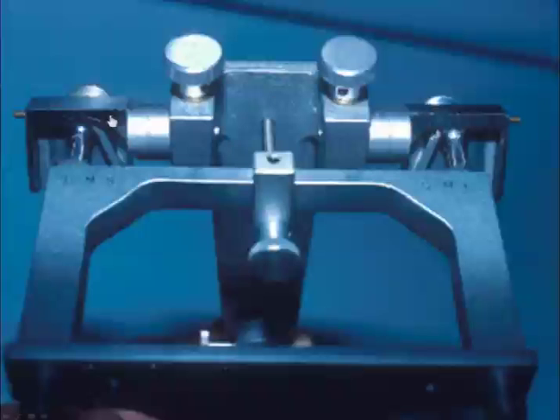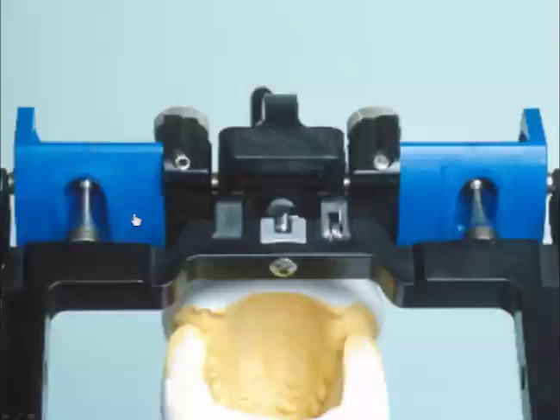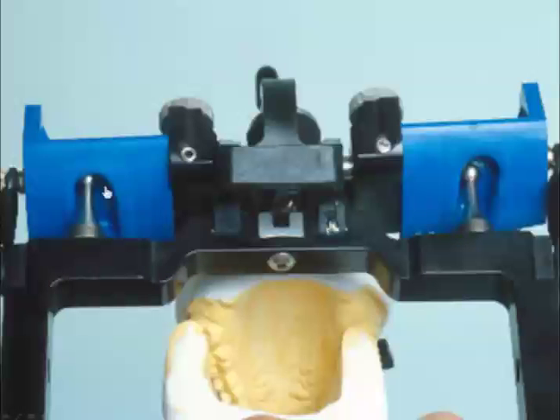So here we're showing the Whip Mix undercompensated straight line articulator going from point centric out to point Bennet, and the patient would chew a little beyond that in a curved pathway. And then here's the immediate side shift articulator. We'd go from point centric, shift straight over to side shift, and then go out to point Bennet, and then back. Very robotic system, very difficult to work with. Versus the curvilinear analog system of the Panadent. As you move the jaw laterally, the working side shifts out, and the non-working side moves inward, downward, and forward on a curvilinear movement, more duplicating lifelike chewing motions.